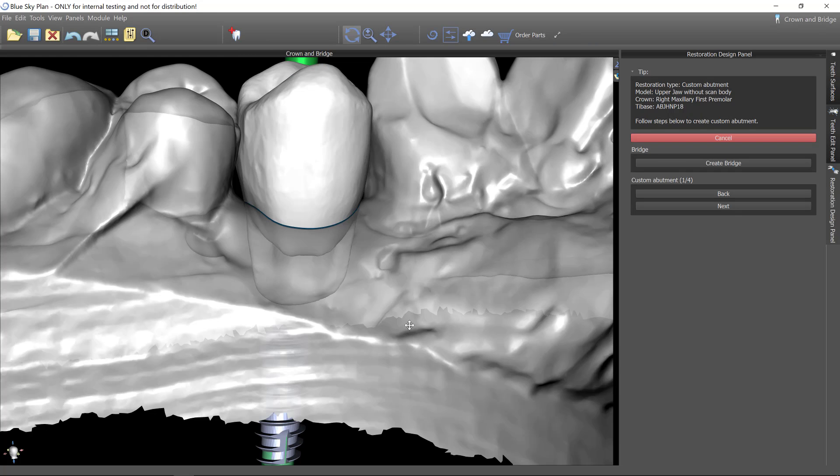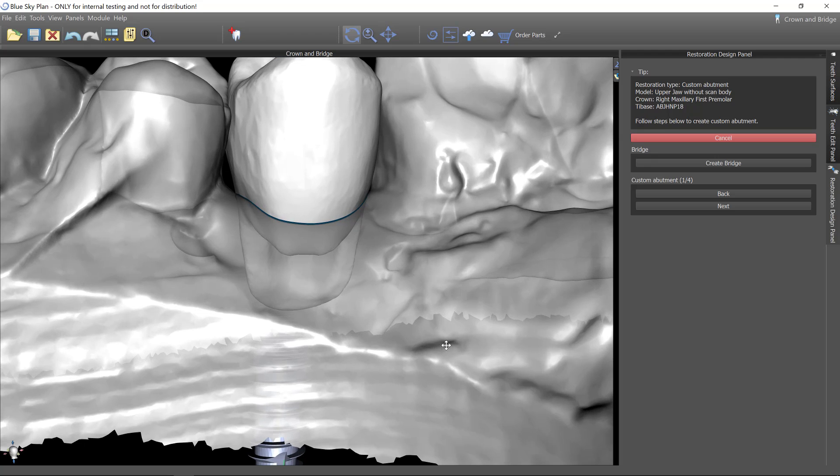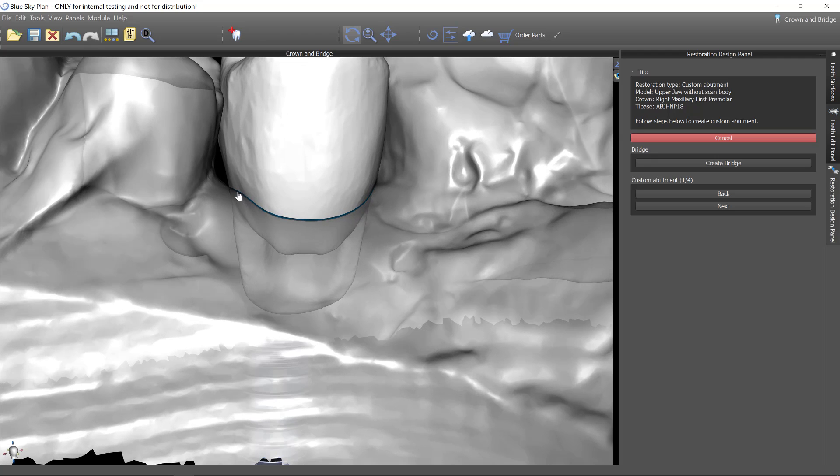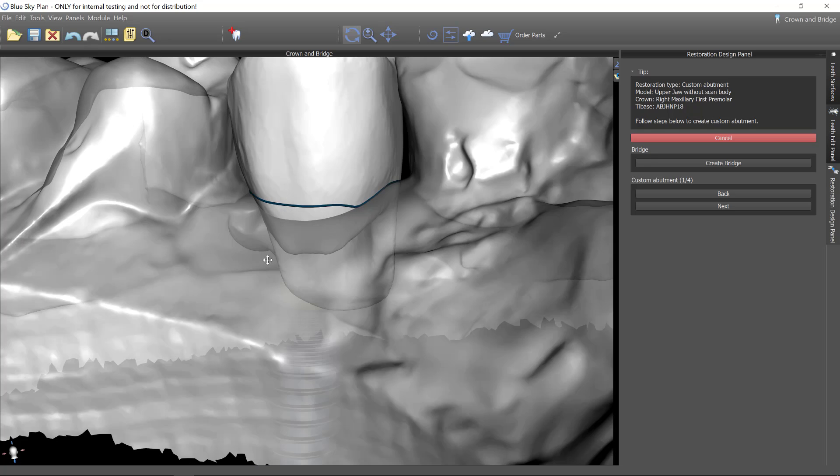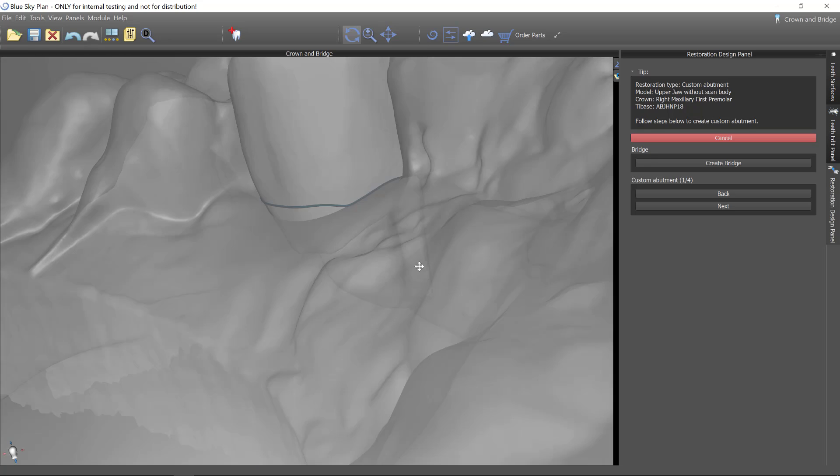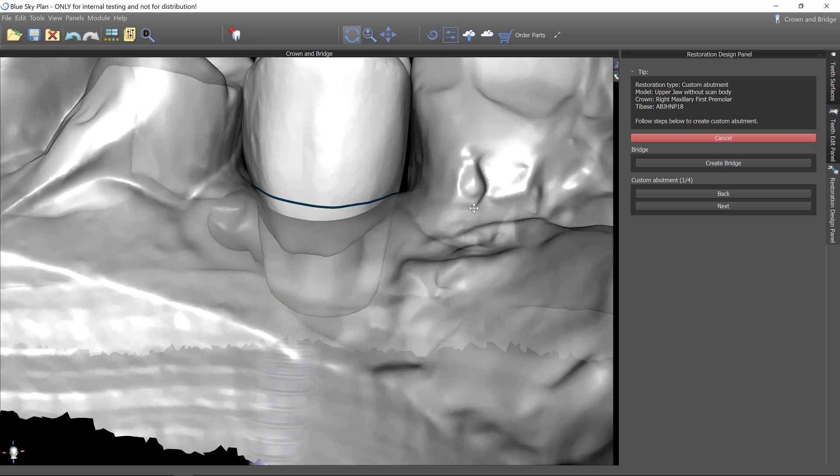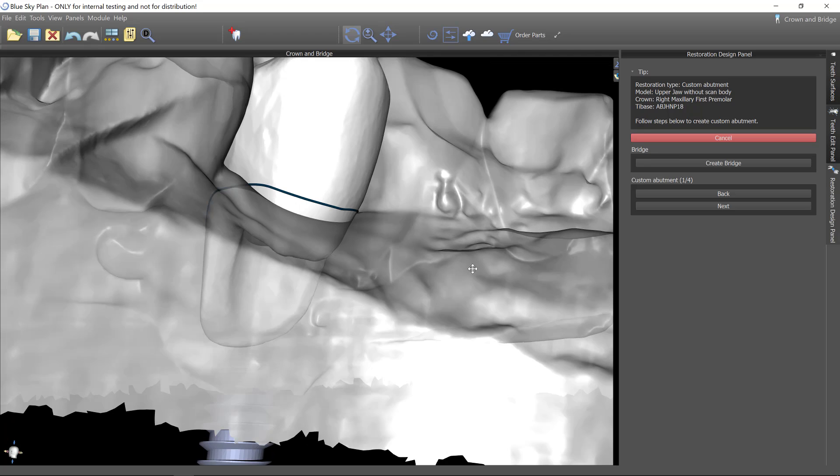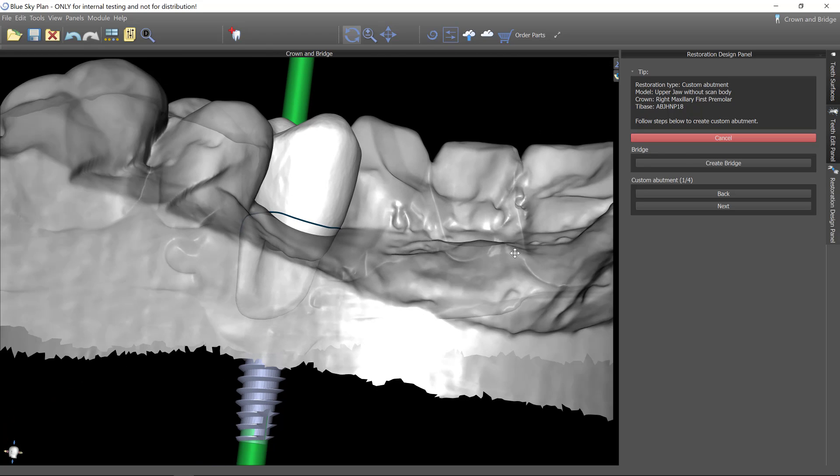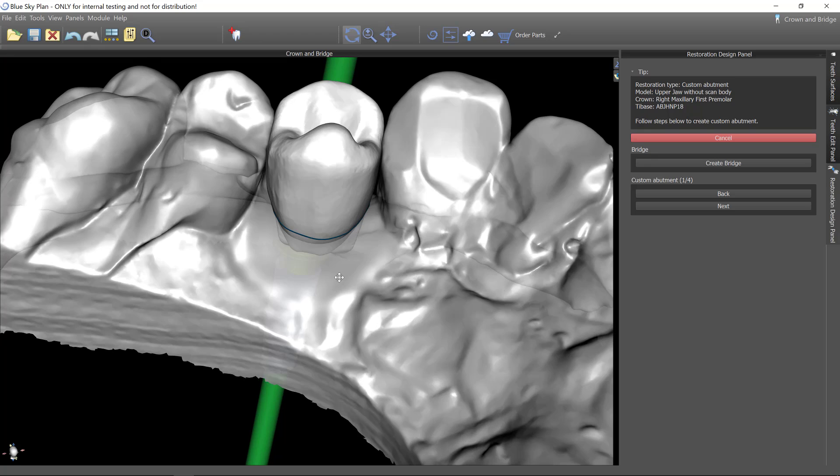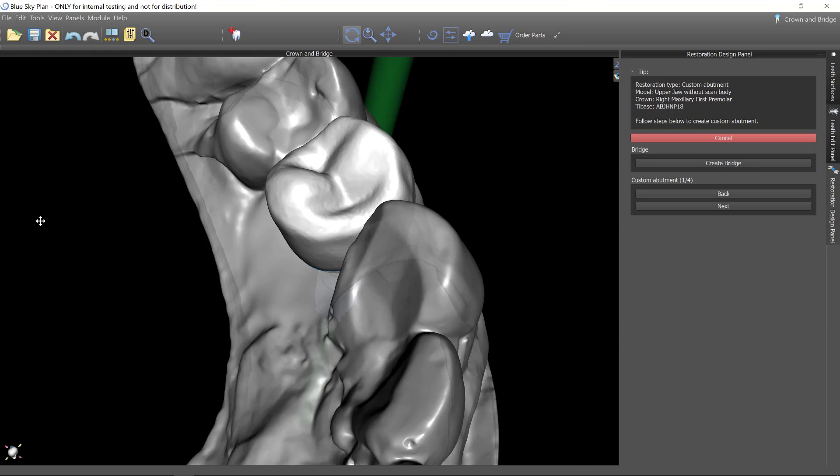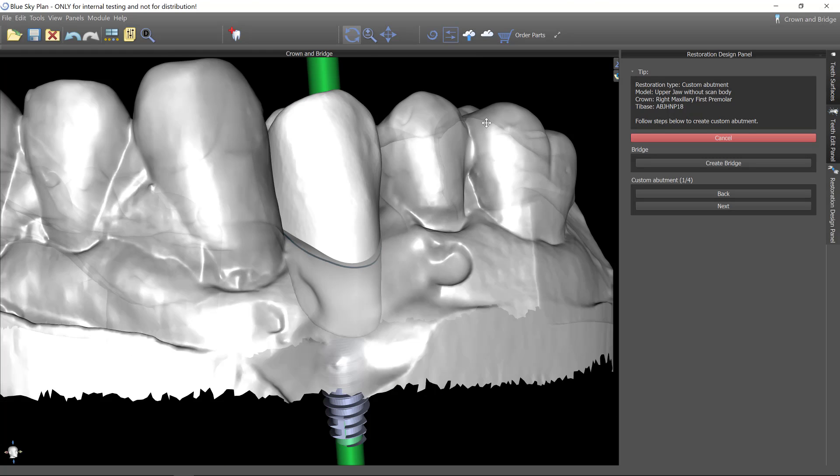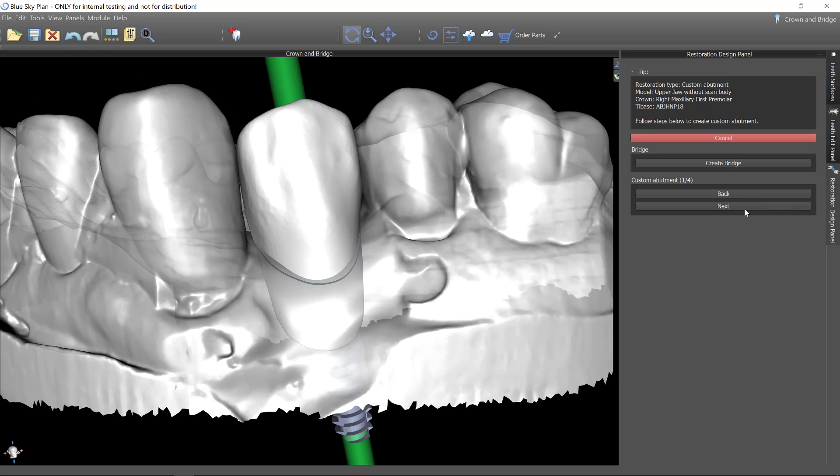So when you're doing cement retained crown, cement sepsis is a big concern. So it's always going to follow the path of least resistance. And so if you've got an actual supragingival area, that's going to be where the cement can easily escape and really leave no tendency to create cement sepsis. So since I started designing abutments like this, I've yet to see a single one where I was even remotely concerned about cement sepsis. So now that I've determined the margin of where that custom abutment is going to be, I'll click next.